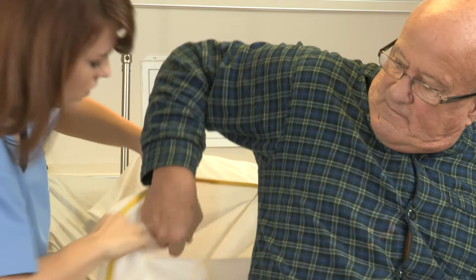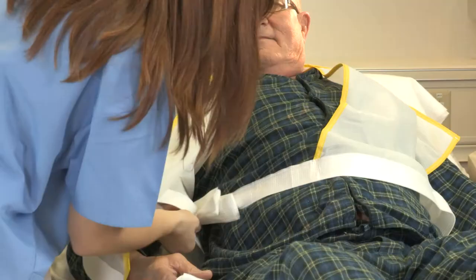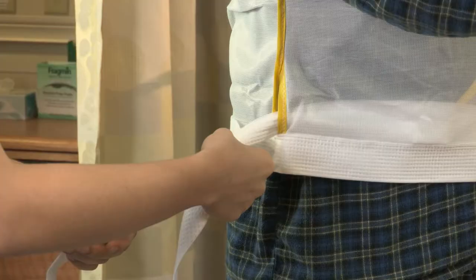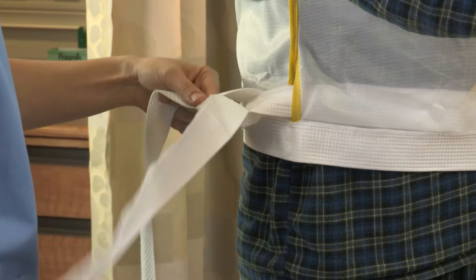Once you have chosen the appropriate size for your patient, first position the body holder on the patient with the opening in the front. Second, interlock the panels by threading the left strap through the opening on the right side. Bring the front and back waist straps together on each side, then tie the straps in a square knot on each side to custom fit the body holder.